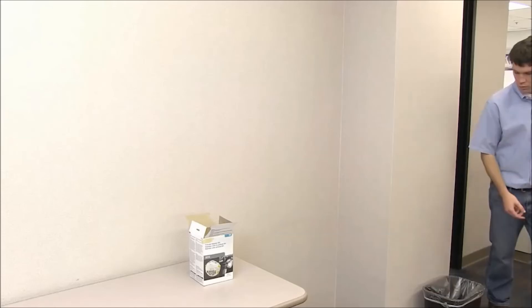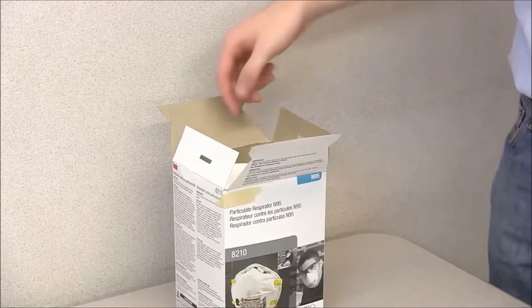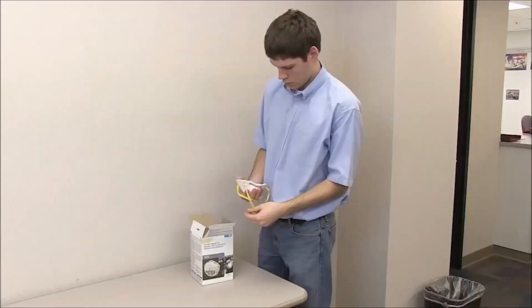If your respirator becomes damaged or you have trouble breathing through it, leave the work area to take it off, discard it, and replace it with a new one.